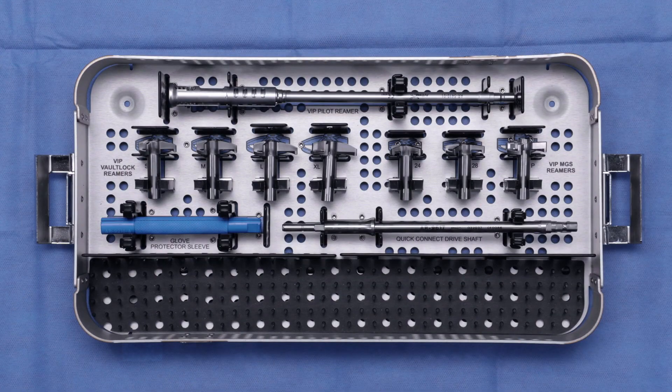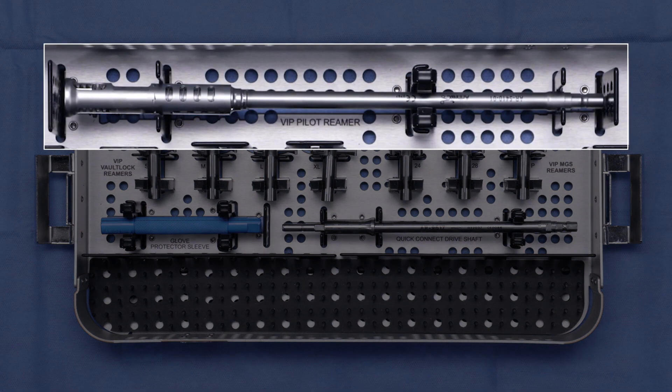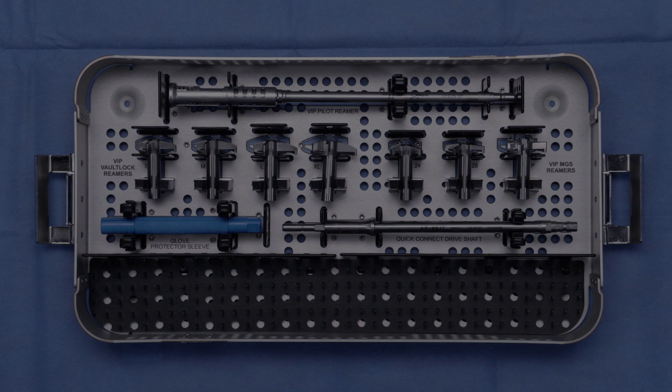Next, I wanted to introduce you to the VIP glenoid reamer tray. It's a pretty simple tray, but I just wanted to highlight a few things. First, we have our VIP pilot glenoid reamer. Next, we have the secondary reamers — secondary reamers for the vault lock and also for MGS — and then the standard reaming equipment from the other trays that you're used to.